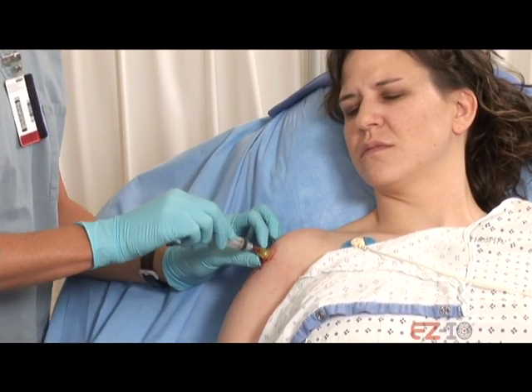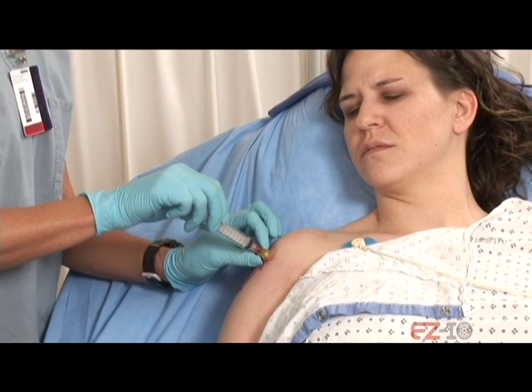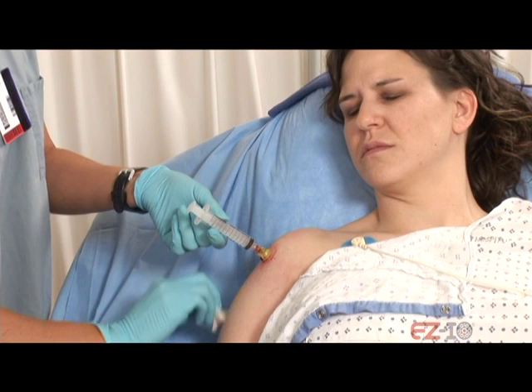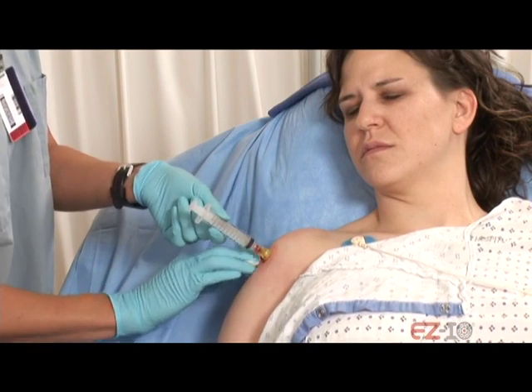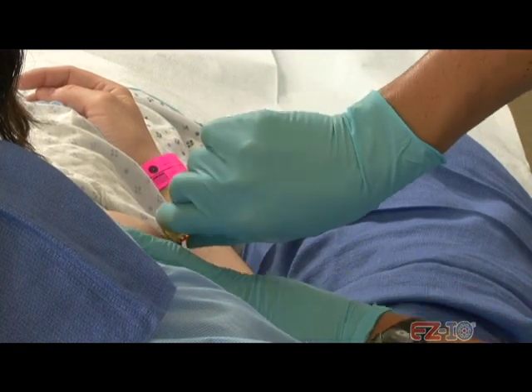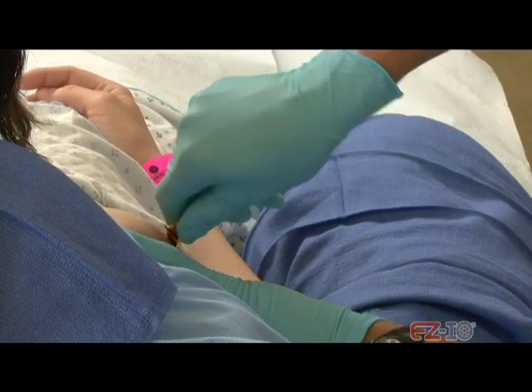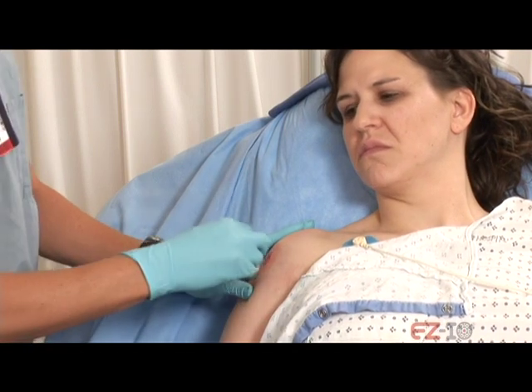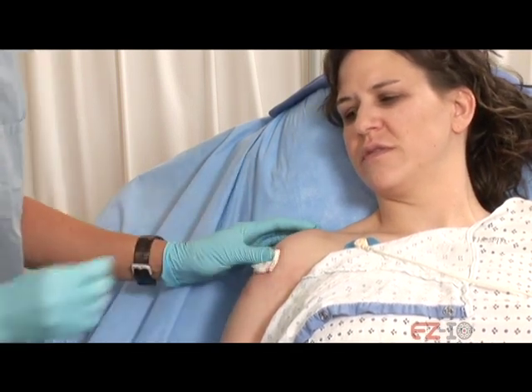And then I'm just putting a syringe on there. So I'm just going to pull this back, okay? Ready? 1, 2, 3. All right. How you doing? Good. All right.